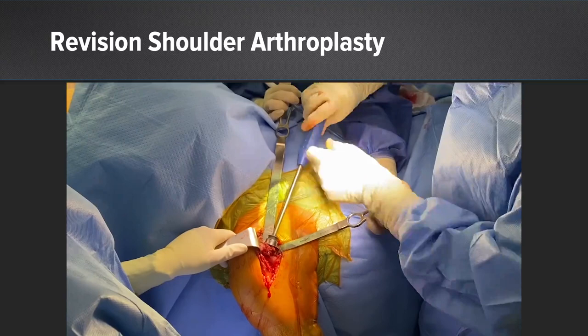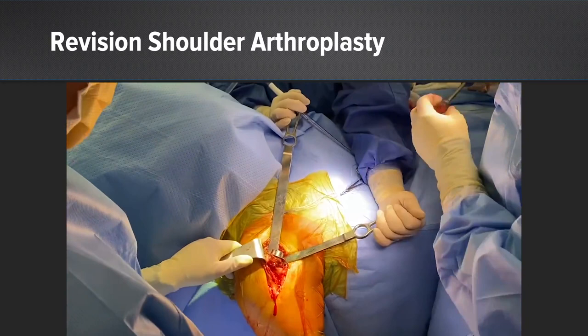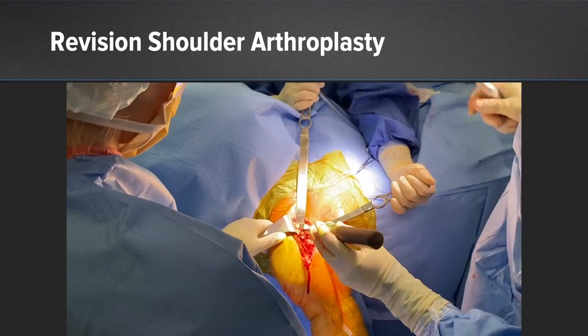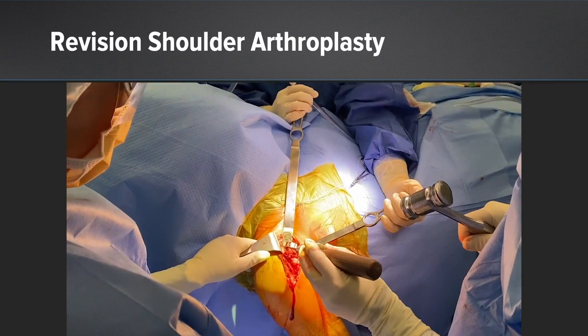There was very good integration of the cage screw as well as the trunnion. To remove the trunnion, I use a small osteotome to get underneath the trunnion to break up the bone-trunnion interface. Once that interface is broken up, the trunnion can simply be elevated up. At the time of surgery, we could see good integration of bone on the backside of the trunnion, but I was able to remove it with very little bone loss.